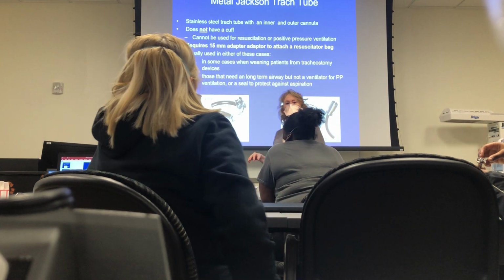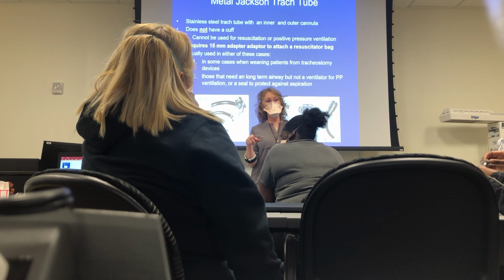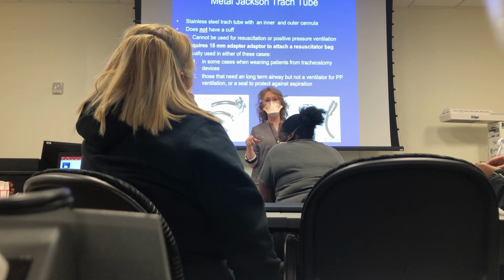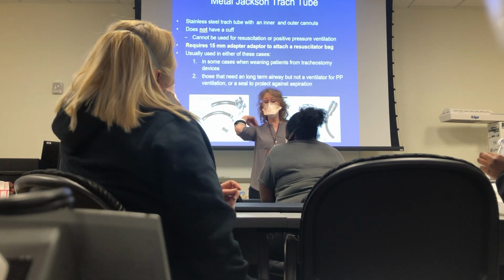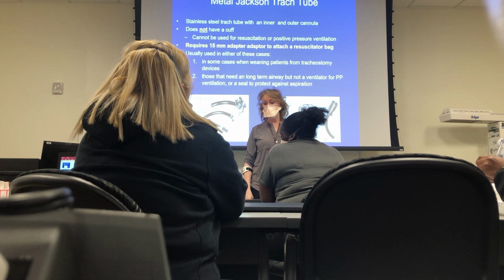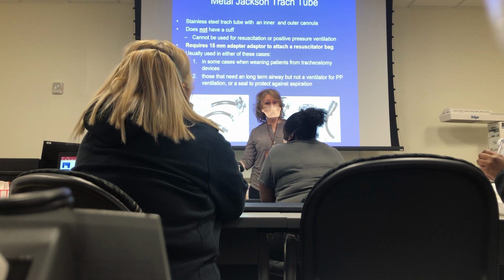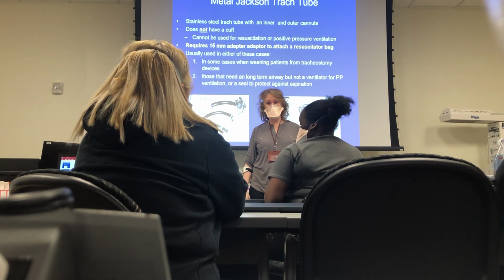So can you put somebody on a ventilator who has one of these in? No. Where's the positive pressure gonna go? You need a seal. So if somebody with a permanent trach has to go on a vent, what do you need to do? Take out the permanent trach, put in a regular trach with a balloon, all right?